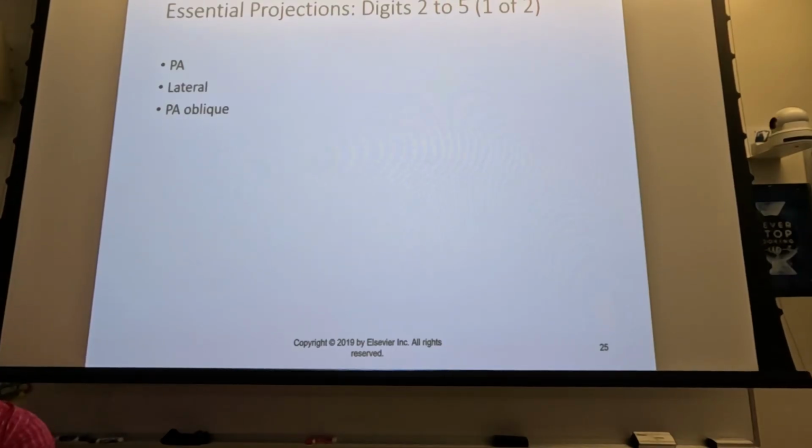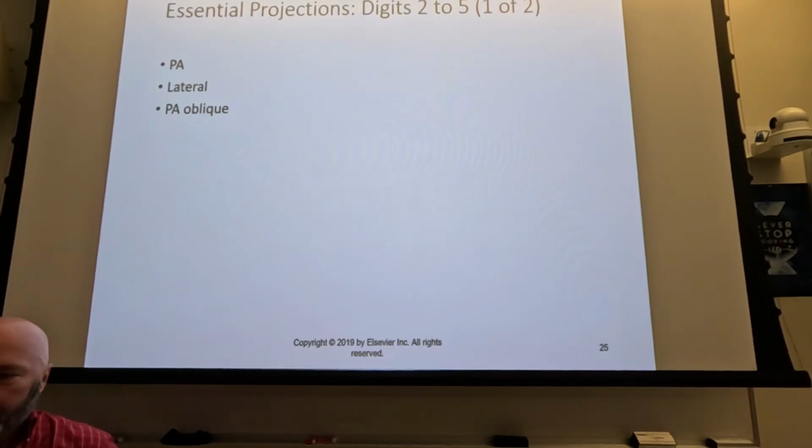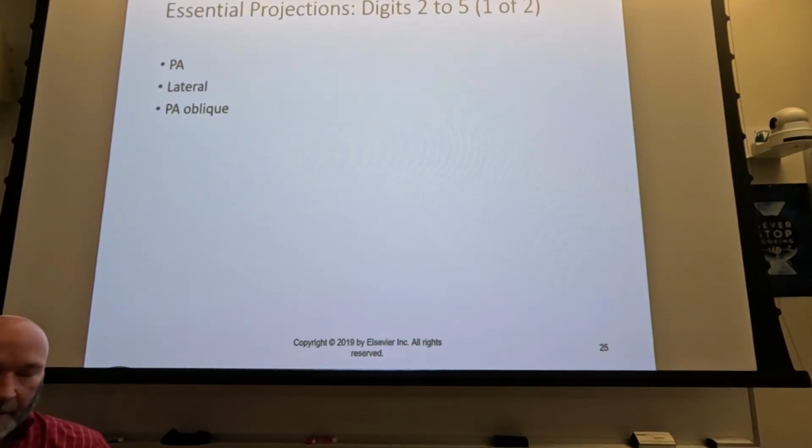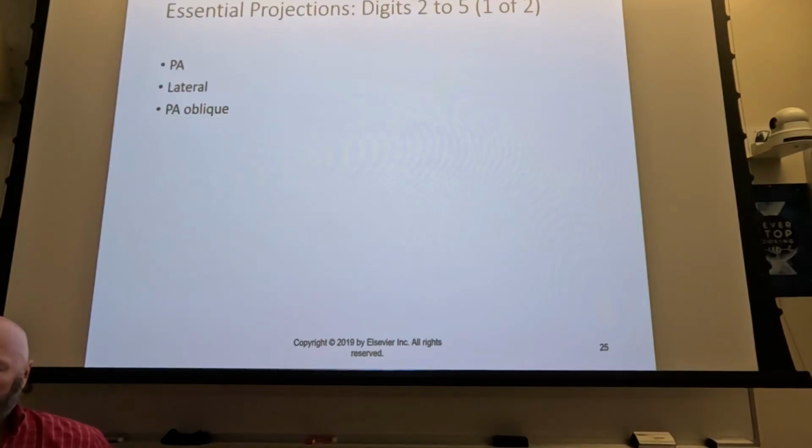You roll them up to the table and you scoot them right up under it. You want to put your hand on this image receptor, this plate. So you're going to make an exposure, and the image receptor has some circuitry in the backside of it, but for the most part it's going to be maybe carbon fiber, some sort of glass, kind of like your cell phone. X-rays go through it pretty easily.